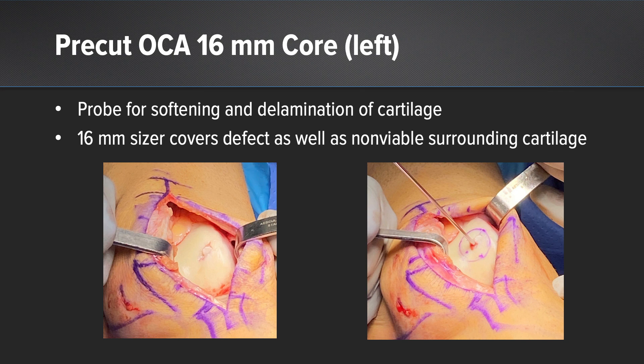The lesion on the left side doesn't look too big, but you really want to probe that area around the cartilage because there's softening and delamination, very consistent with the MRI. I decided to use the 16 millimeter pre-cut core. There's a sizer you can put directly over that lesion, and with the circle around that lesion, I put the guide pin down the guide. That covered most of that delamination along that cartilage.